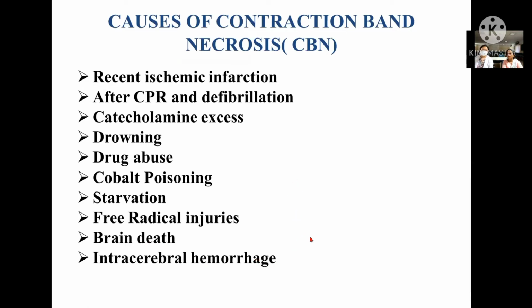Yeah. So this patient, we're not discussing all the other features that this case had, but we received only the heart and a part of the lungs. Both the lungs were very characteristic. They showed malignancy. Remember? Malignancy, yes. And this case had intracerebral hemorrhage, pontine hemorrhages, and all that. So our point of discussion was only a microscopic, histological finding in the myocardium, in H and E stained sections, that is the contraction band necrosis.